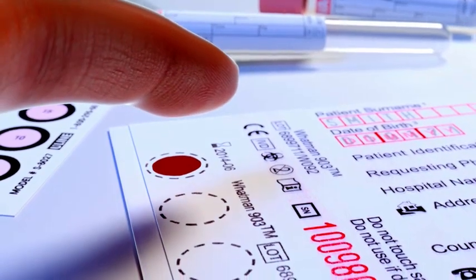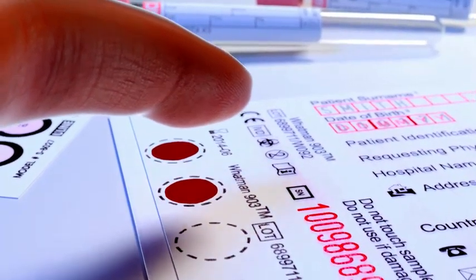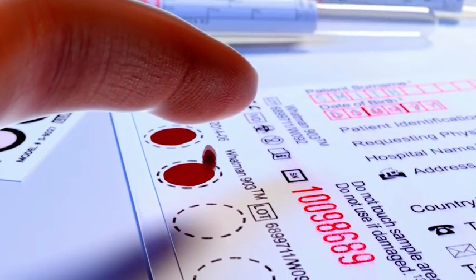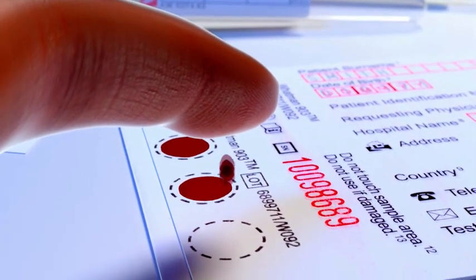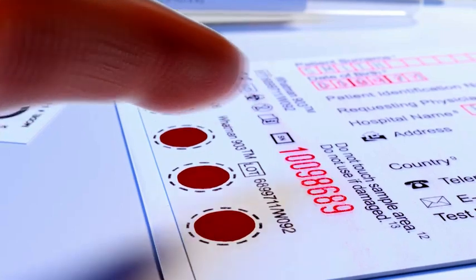The first uses a lancet to prick the side of the tip of the finger. Avoid taking samples from the fifth finger. One drop of blood should be applied per circle on the DBS card. The blood should cover the whole circle.